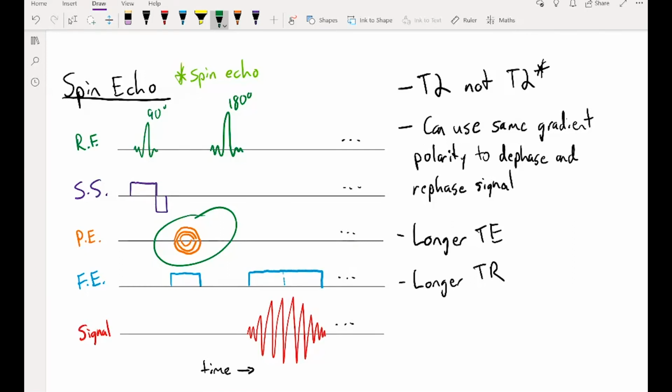So some conditions where the phase encoding gradient is weakly positive or weakly negative. You know, for any given iteration of this pulse sequence, we're only going to have a phase encoding gradient that is at one of these settings in the little ball that I drew before. But it's typically represented as a circle just to show that we're varying our phase encoding gradient in order to collect information from spins at different phase encoding frequencies.